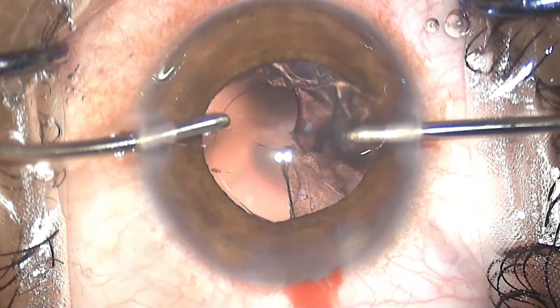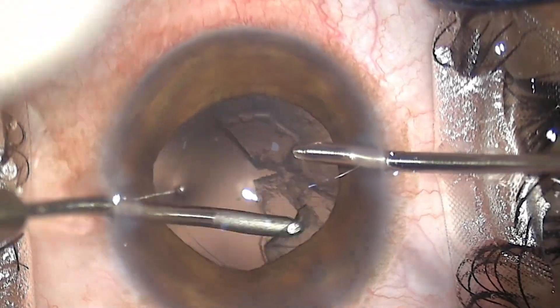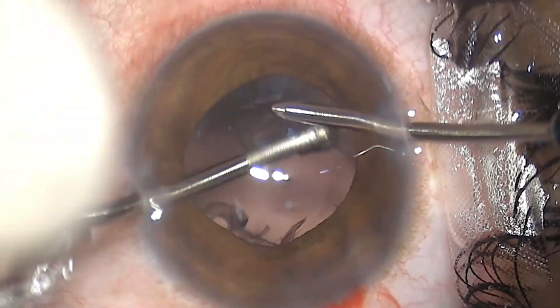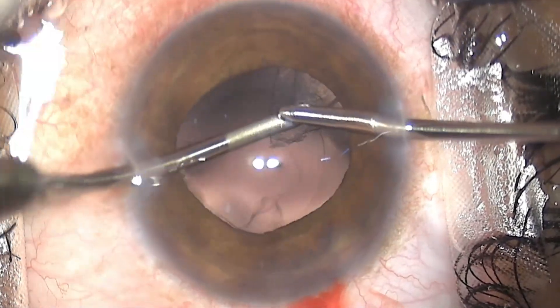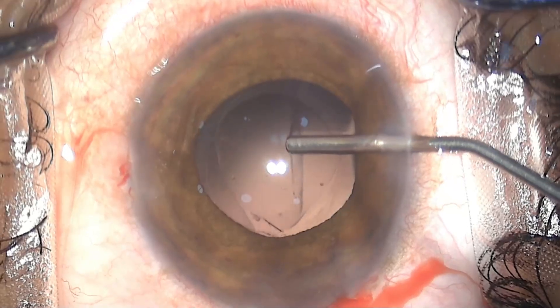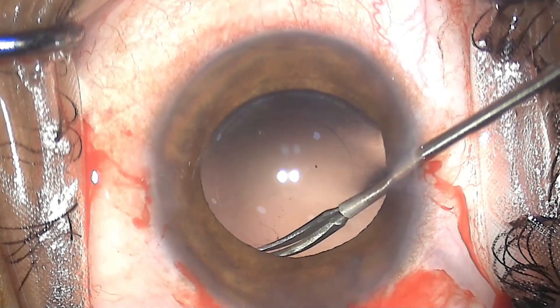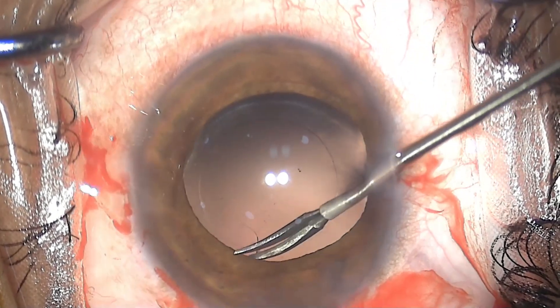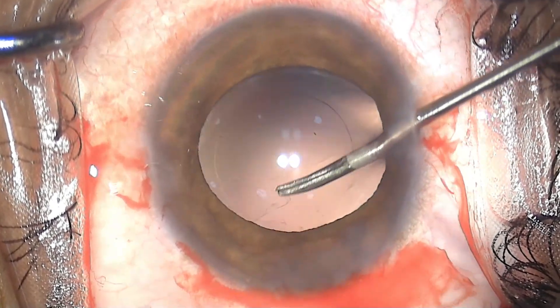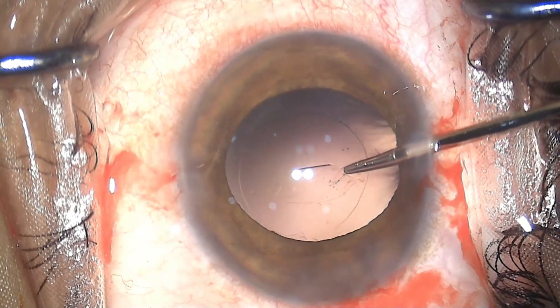...see at the six o'clock position, it's gone to the periphery — exactly where the equator of the nucleus was — and it has also created an anterior capsular tear. So we need to fix that: go in with micro scissors, create a nick, and use some good grasping forceps.